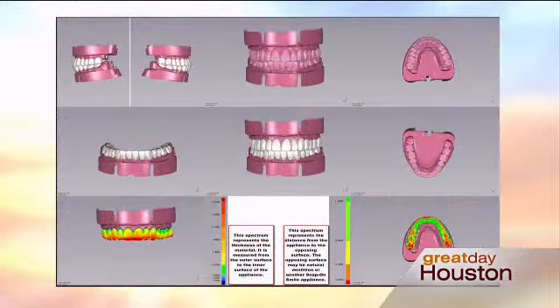And the patient comes in, they come in for a full set of x-rays. Here you can see the digital previews, so you actually have an idea of how it's going to look when we receive it back from the lab. Patient has to have their teeth cleaned just like anyone else. Yeah. Any decay, should be your basic routine. Exactly. Any decay taken care of, and then boom, it's done in a snap.